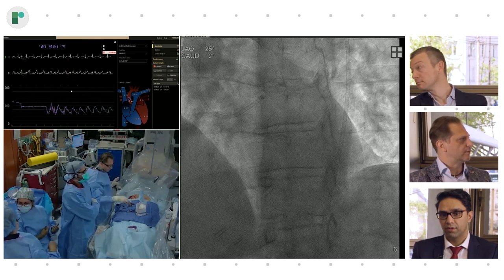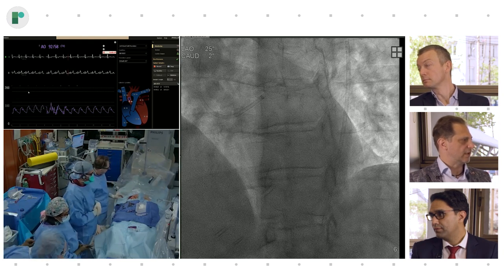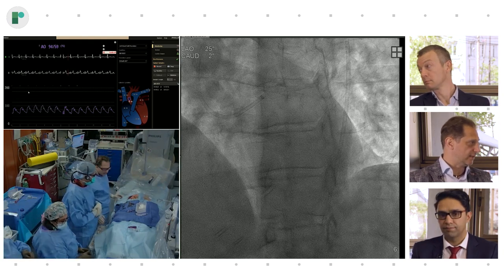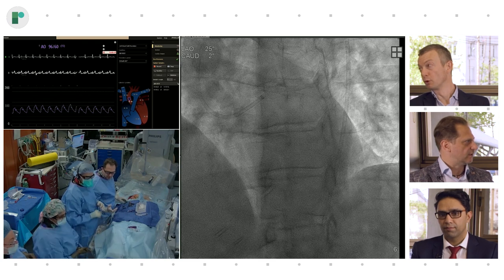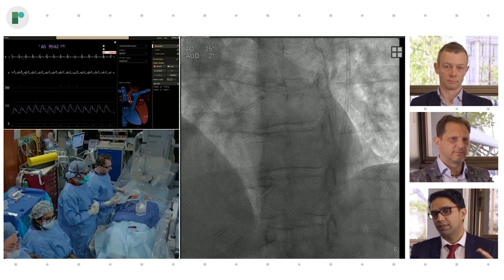The other thing you can do, of course, especially when you do a procedure like this, the patient is heparinized, and we have a guide wire in the guide in this case, and then we just probe a little bit with a very soft, safe wire. Mm-hmm. So maybe those two techniques can be differentiated.